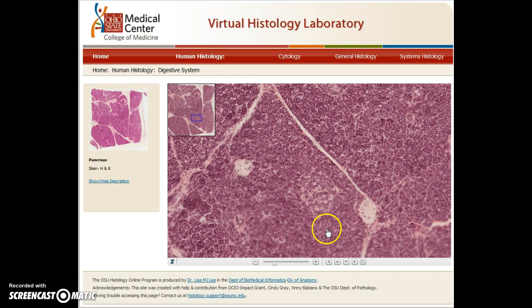So I hope this video helps you identify some of the histology of the lower digestive tract.